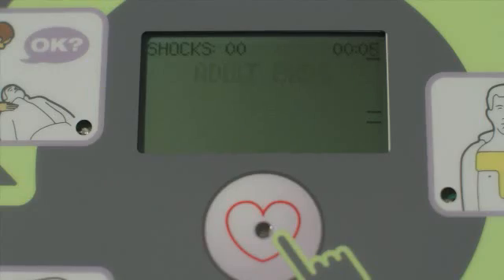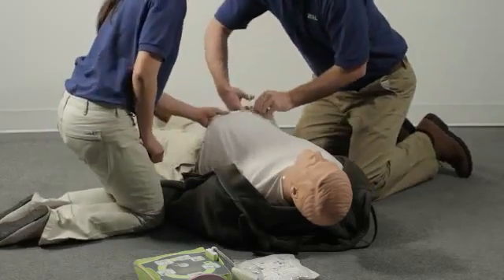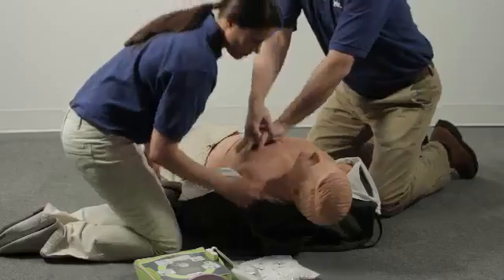Unit OK. Adult pads. Stay calm. Check responsiveness. Call for help. Proceed immediately to attach the electrode pads to the victim's bare chest. Attach defib pads to patient's bare chest.